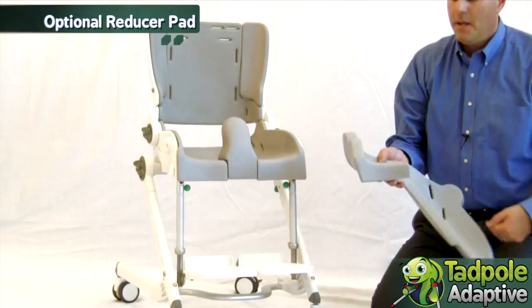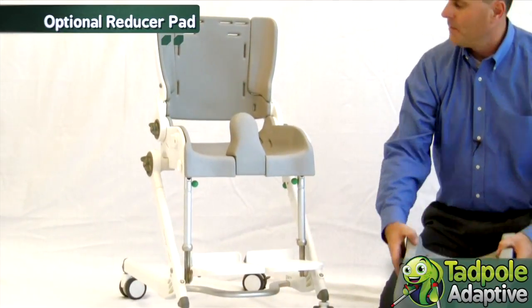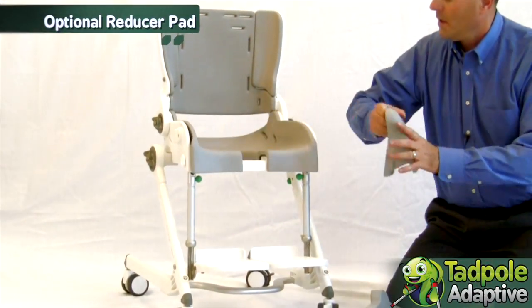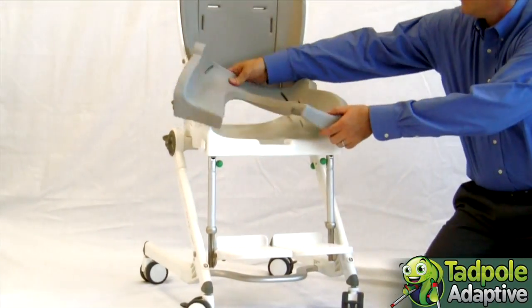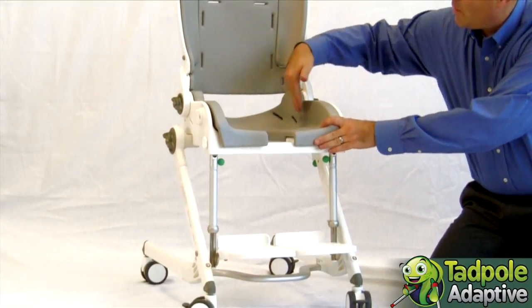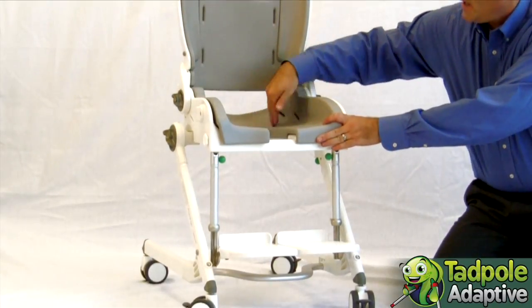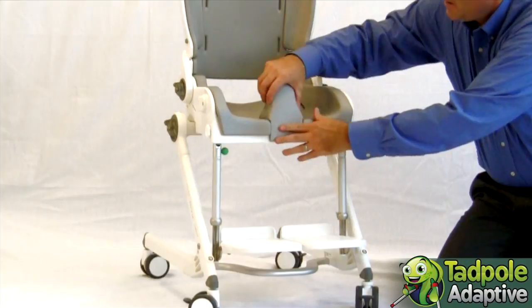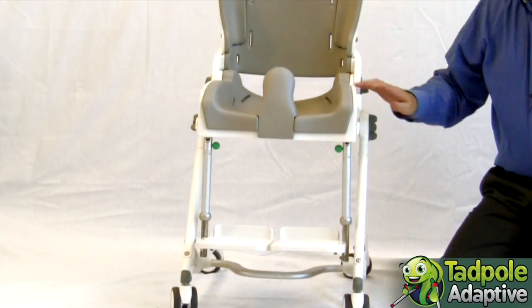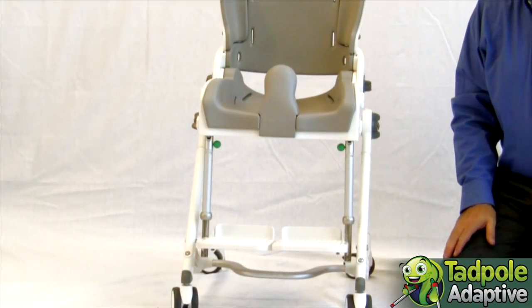Another nice accessory is our reducer pad. This is a seat pad that reduces both the width of the seat and the width of the cutout. It's especially useful for those long and lean children.